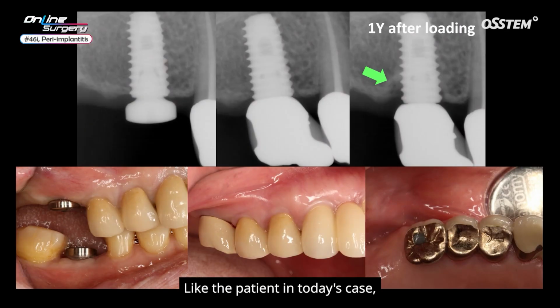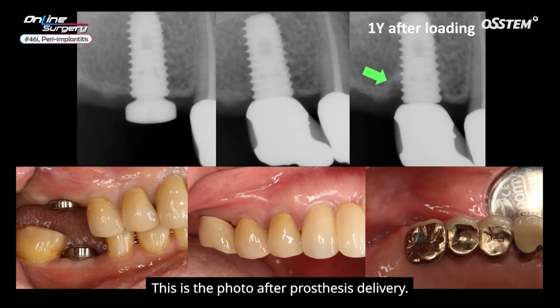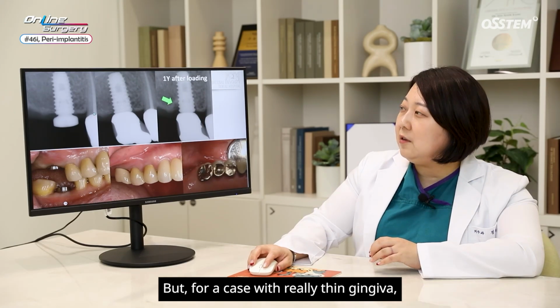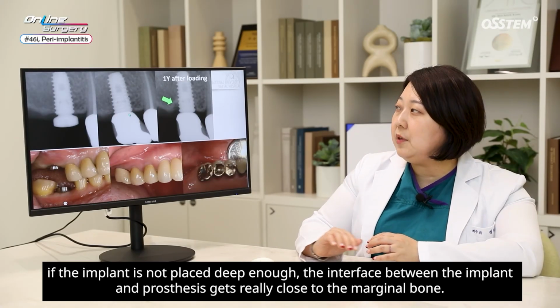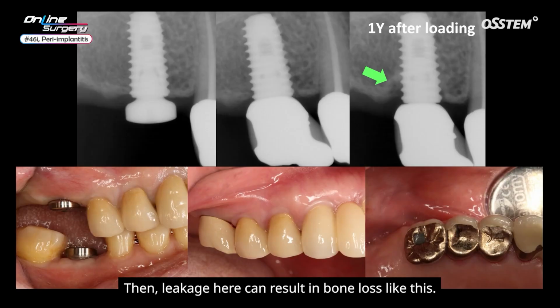Like the patient in today's case, this patient also has a very short healing abutment, and the gingiva is really thin. This is the photo after prosthesis delivery, but for a case with really thin gingiva, if the implant is not placed deep enough, the interface between the implant and prosthesis gets really close to the marginal bone. Then, leakage here can result in bone loss like this.